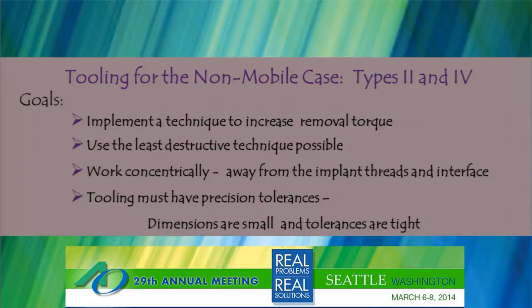And get under a surgical microscope, either borrow or buy one. For 2 years, I was under an endodontist's scope across the street from my office. That's a great place to find them. If this was an endodontic meeting, everybody's head would be going yes. Everybody in the endodontic community uses them now, especially in our area.